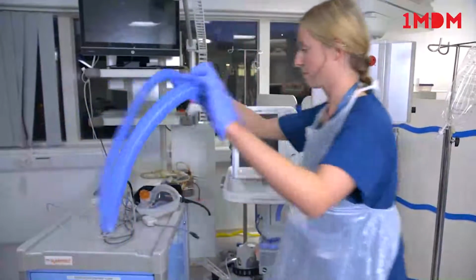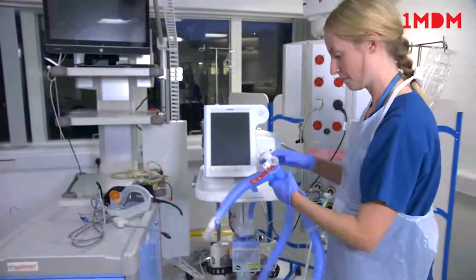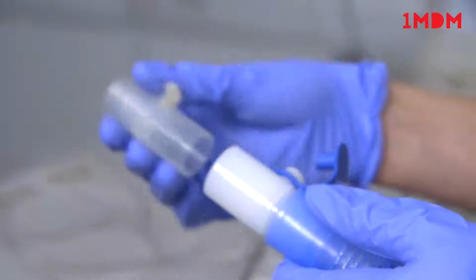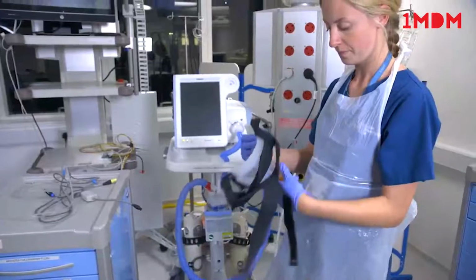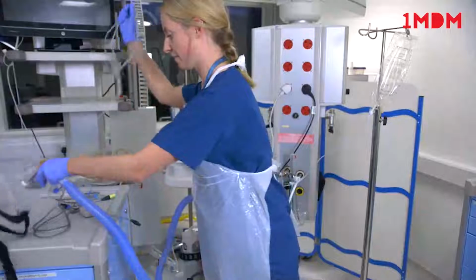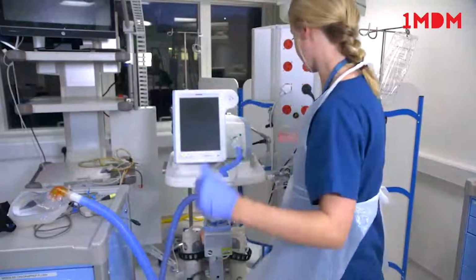Next, prepare the mask using the larger piece of the circuit by attaching to the humidification box and place the port at the patient end. Attach an appropriate size mask and ensure the pressure cable is attached at both the ventilator and mask end.